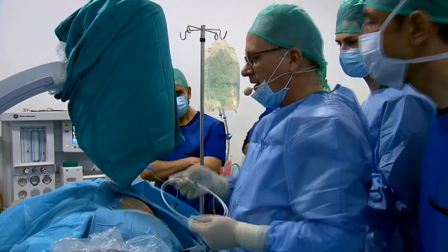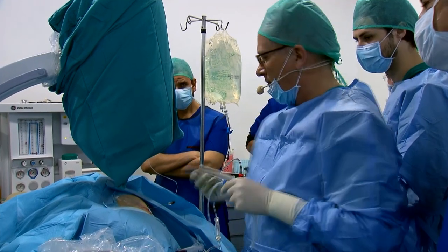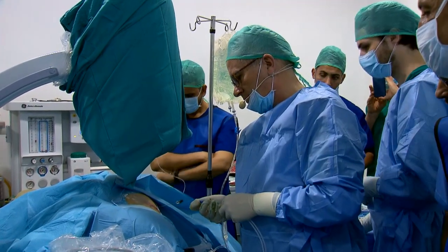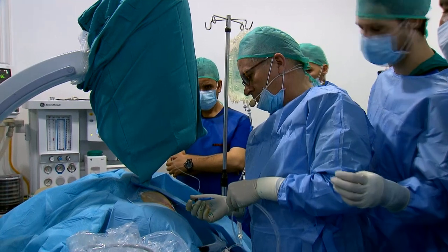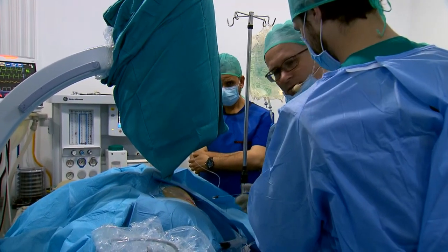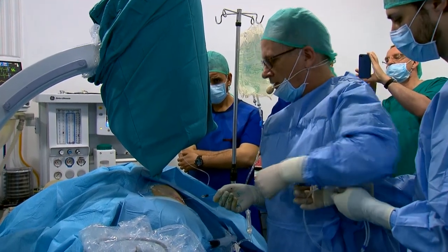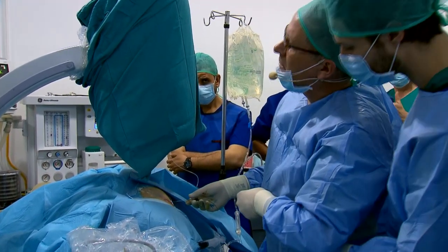So, next step is we're using a stainless steel guide wire. This is a very cheap one. It's a J-tip? Yes. You have to get out of the picture. Okay, this is done under fluoroscopy, please.